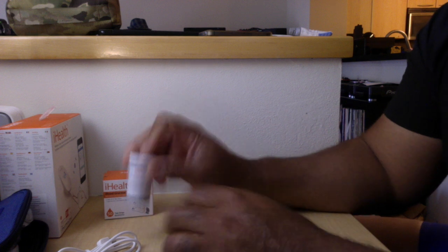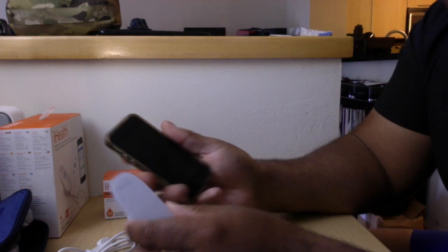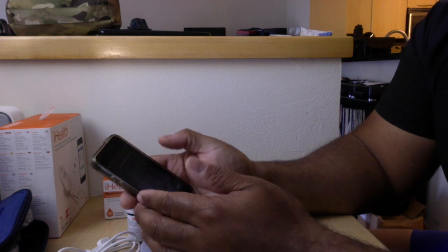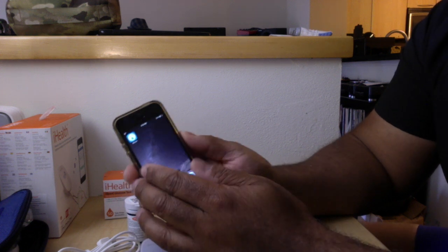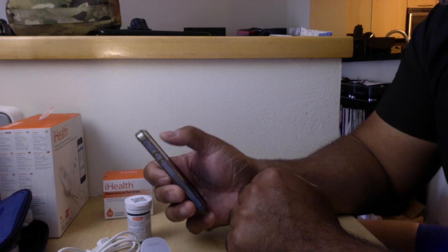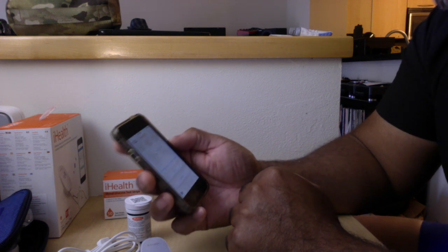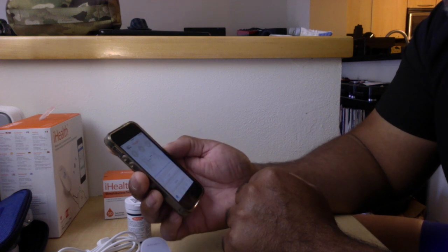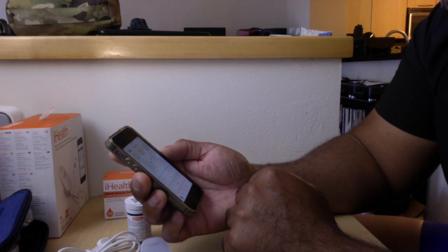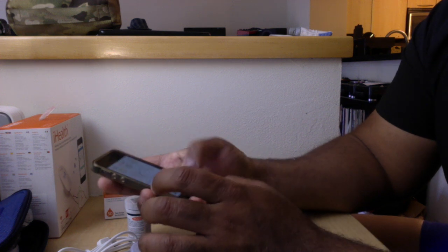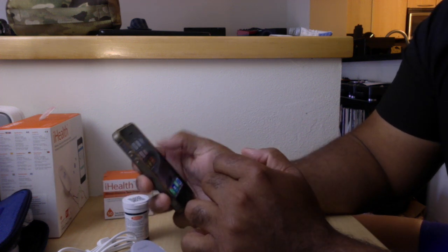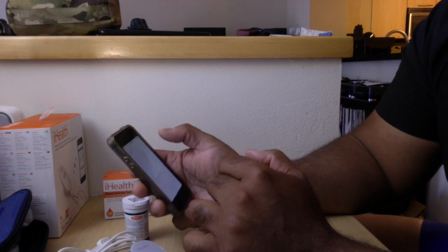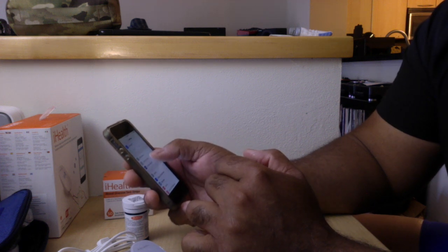All right, so we've got this, we've got the phone, and I went ahead and downloaded the app so I have that on here. We're going to go ahead and open it up, and when you open this up it's going to ask you to register an account, just go ahead and do that. I've already done that.